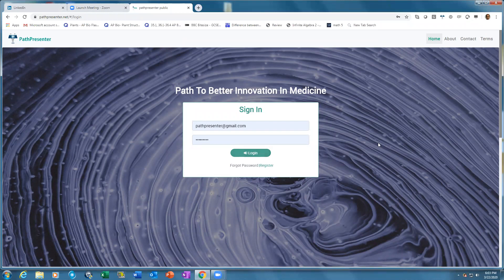Today I'll show you how to use the High Yield section on PathPresenter. The High Yield section is built for residents and fellows that are in training. Currently there are more than 30,000 slides on PathPresenter, so it would be very difficult for residents to go through all of them. What we have done is taken the bread and butter cases and put them in a High Yield section.